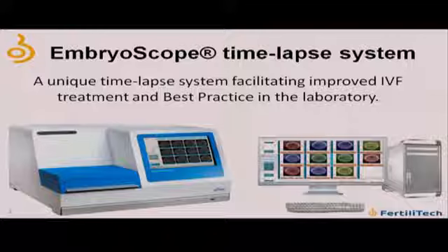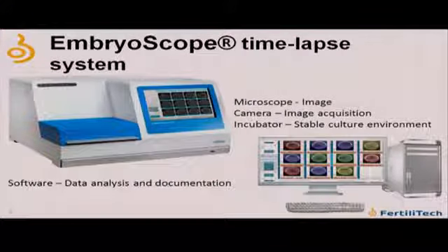I wanted to, before we start, tell you a little bit about the EmbryoScope time-lapse system, because if I don't tell you what the technology is that we're discussing, you might not understand the high level that you'll hear from our speakers today. And afterwards, I'll introduce you, okay? So here's the EmbryoScope time-lapse system. I'm not sure if you're familiar with this, but it's essentially two components. It's first the EmbryoScope, which is the incubator, the box you see on the side. And there's also a microscope inside and an imaging camera.